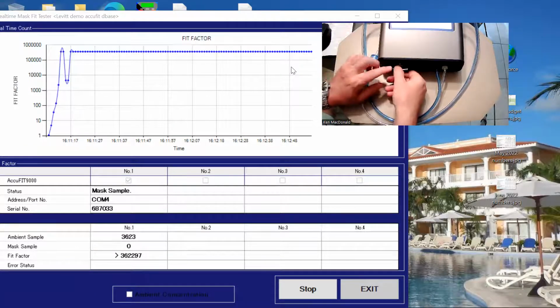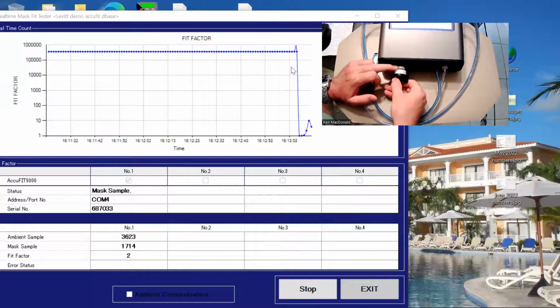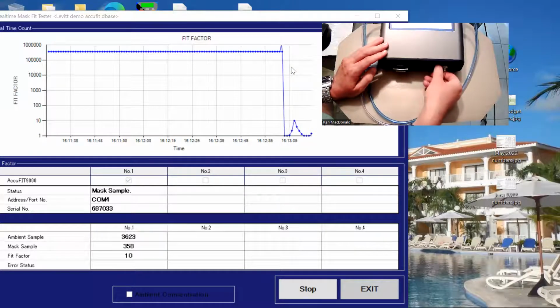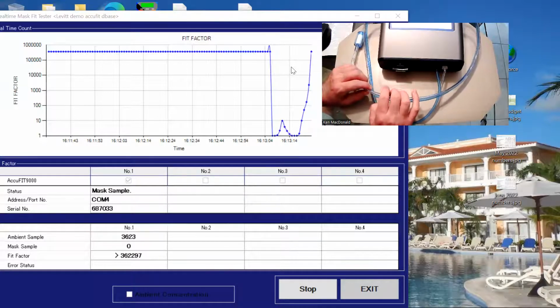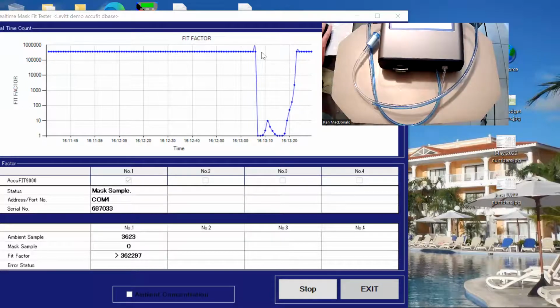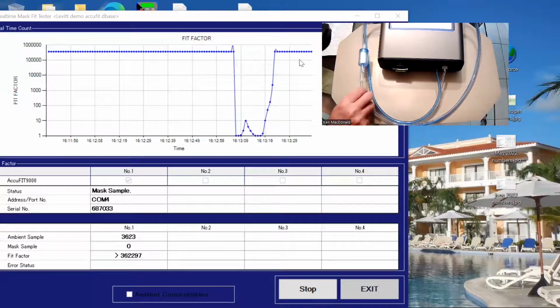So let me just see, if I cause a leak here with the alcohol cartridge, let me just see here. So you can see, and things like this can happen eventually. That large O-ring can leak and let air in. Also, these fittings here should be tight. Over time, maybe there might be a nick in the tube itself. So moving the tube around, if I was to see that drop, then I would know there's an issue. So it's a way of troubleshooting by using the HEPA filter. So I hope this helps.